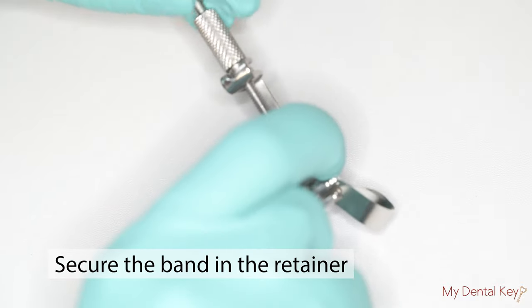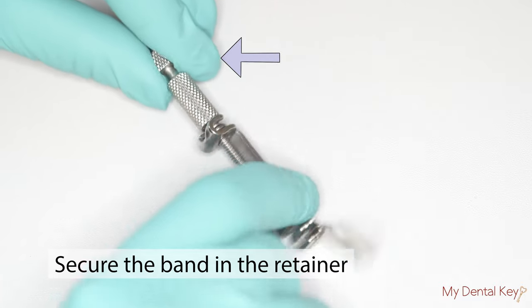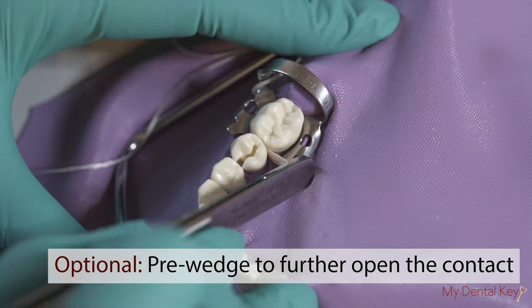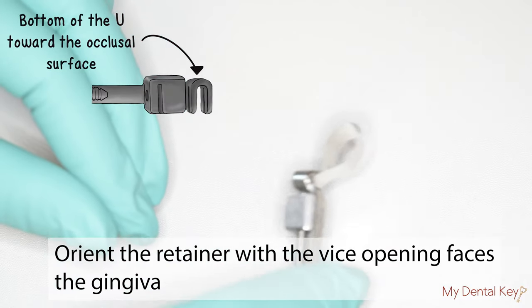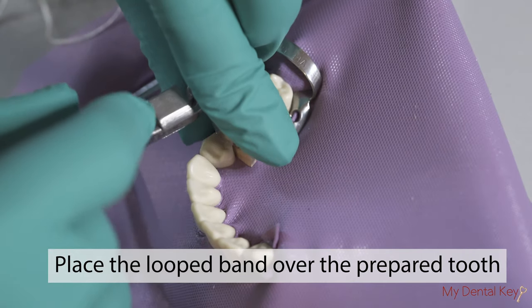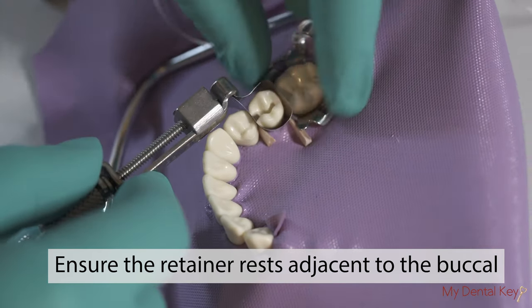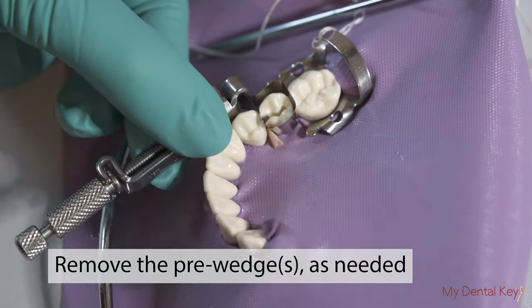Secure the band in place by turning the locking nut in a clockwise direction. This will prevent the band from slipping out of the retainer. You may also pre-wedge to further open the contact. Orient the retainer such that the open end faces towards the gingiva. Place the loop over the crown of the tooth being restored. The retainer should rest adjacent to the buckle and should not be placed lingually or rest on any teeth. Remove the pre-wedge as applicable.